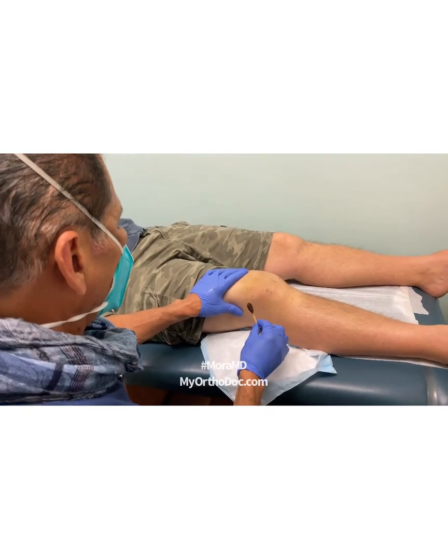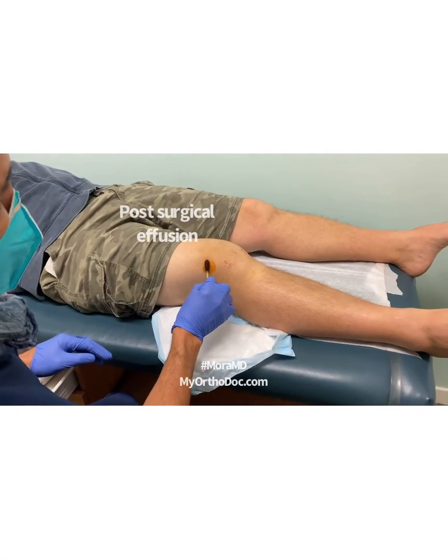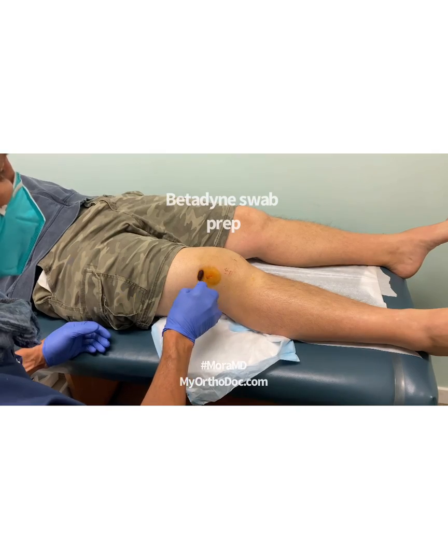This is Dr. Moore here taking care of one of my favorite patients. We're going to aspirate his post-surgical effusion. I'm going to guess it's most likely going to be blood, because we just operated on him.